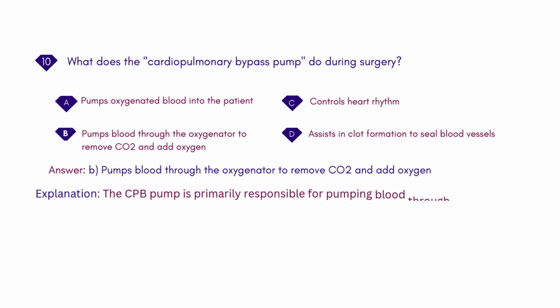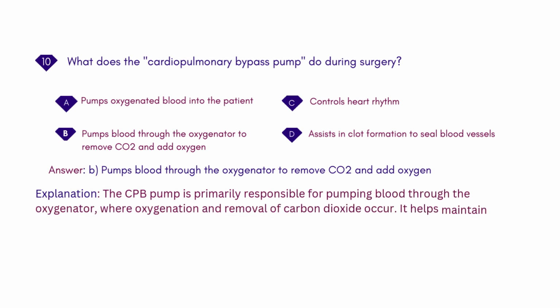Explanation: the CPB pump is primarily responsible for pumping blood through the oxygenator, where oxygenation and removal of carbon dioxide occur. It helps maintain circulation when the heart is stopped during surgery.